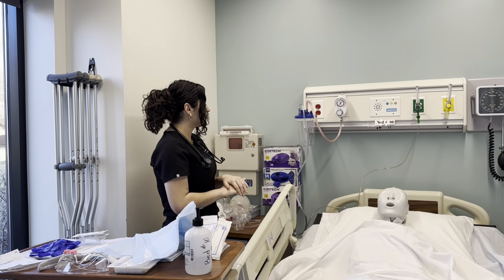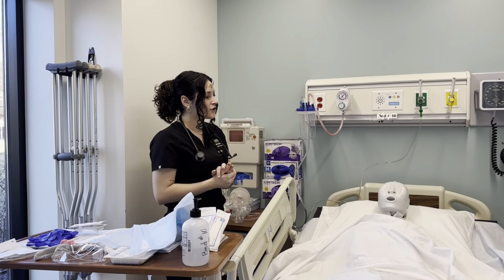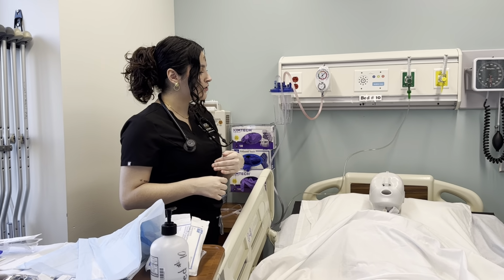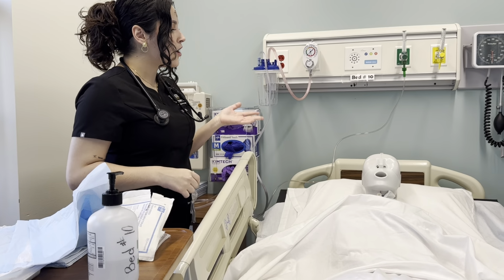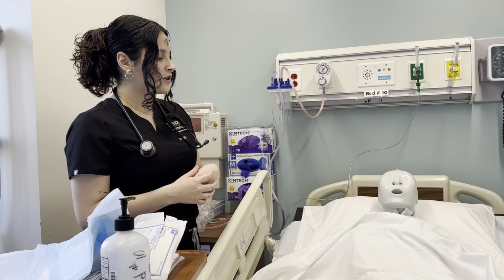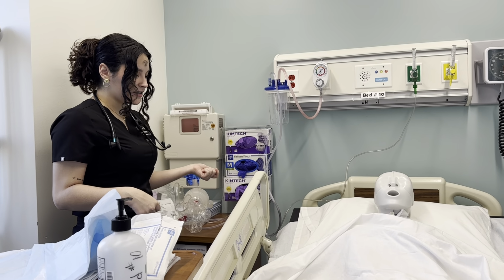Wonderful. So I see in your chart that you are due for trach suctioning and trach care. The reasoning for this is so that I can take out all the mucus and you are able to breathe properly. Are you currently experiencing any pain? No. Okay, if my patient were, I would administer pain meds as needed.